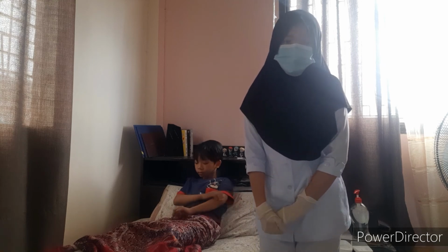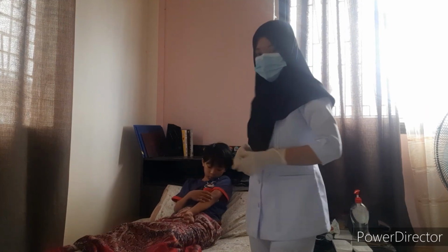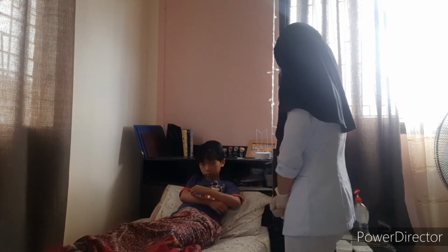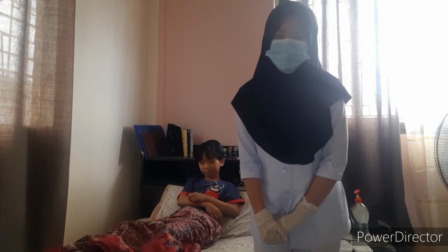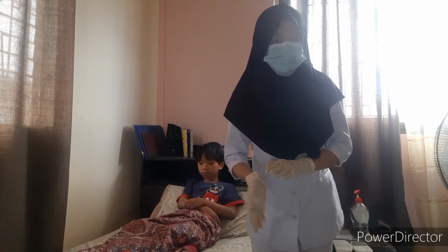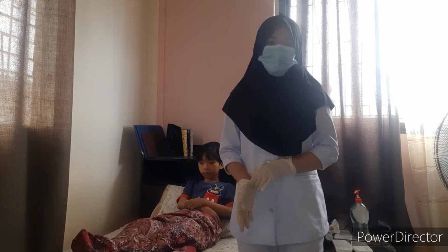So the next step is to inform the client of the temperature reading. So sir, your temperature in your ear is 35.7. Okay, so it's normal. So this is for the patient to be aware of the result. Next, we have to remove the gloves and perform hand hygiene. So this is to prevent the spread of microorganisms.